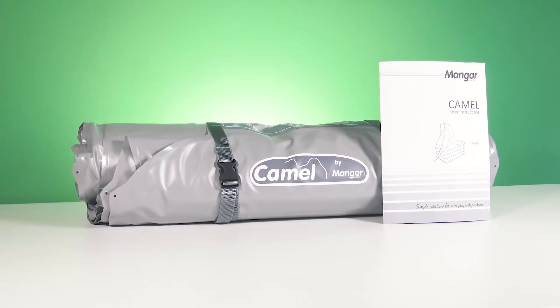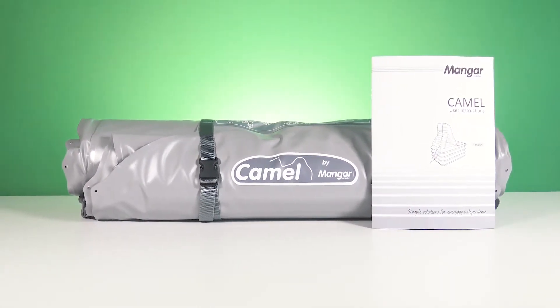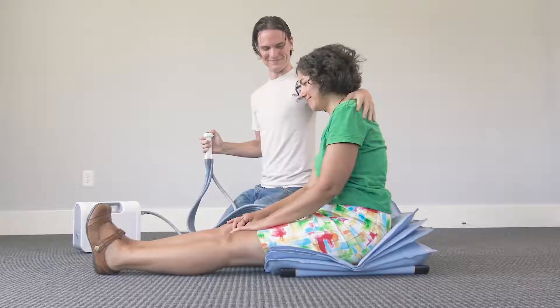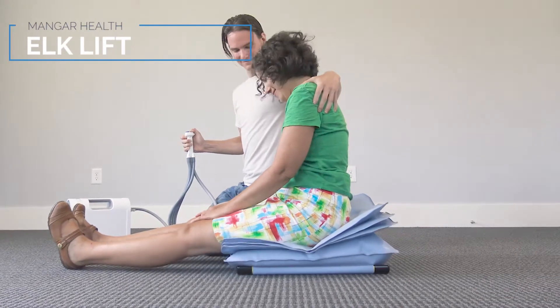So who is the Camel for? If you need a portable, easy-to-operate lift that can raise an immobile patient completely off the ground and sit them up, then this might be the right fit for you. If you need the extra portability and the ability to lift in tight spaces, Mangar's Elk is a bit more compact, as long as your patient doesn't need the extra assistance sitting up.